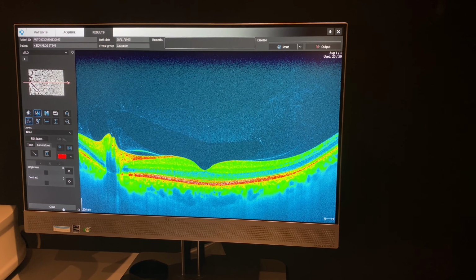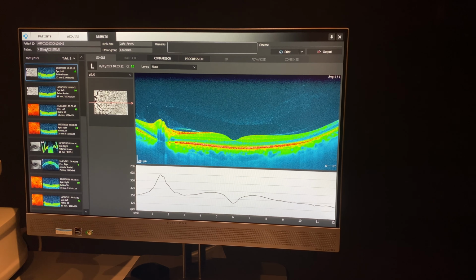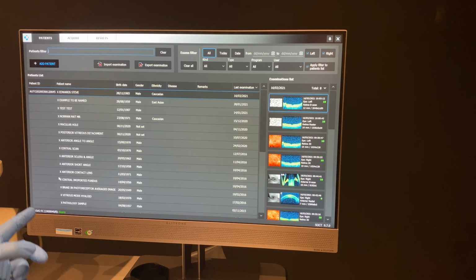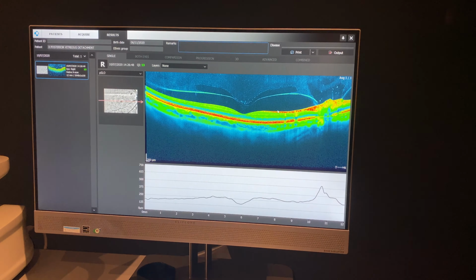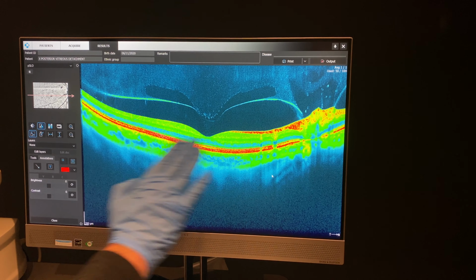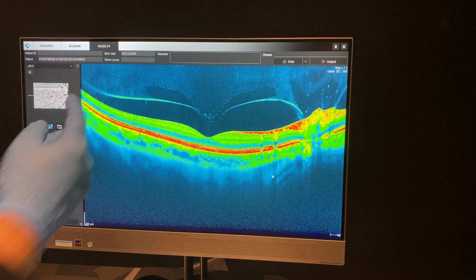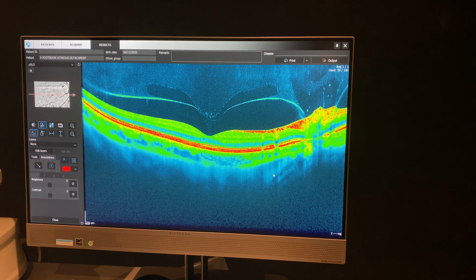And I have found a PVD on a customer who knew she had it, but she let me keep her image. So if I go back to patients, posterior. Wow. So I didn't ask for detail in the retina, I asked for detail in the vitreous. And that's a B scan, is it? That's a single B scan, yeah.